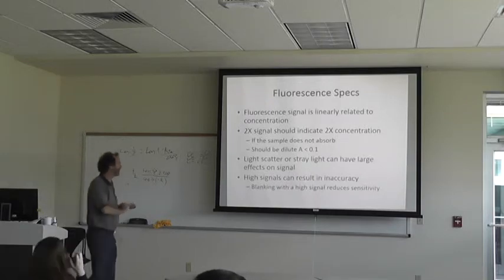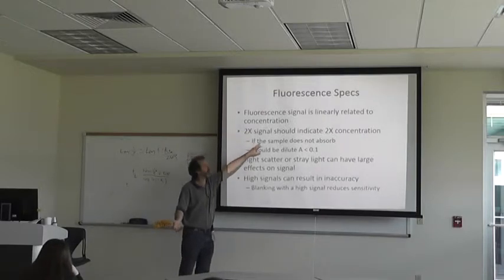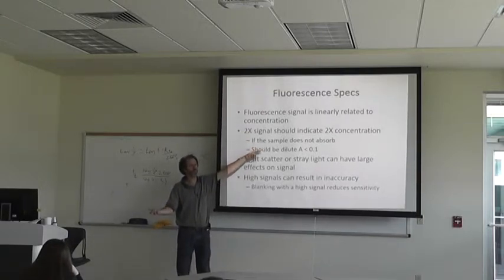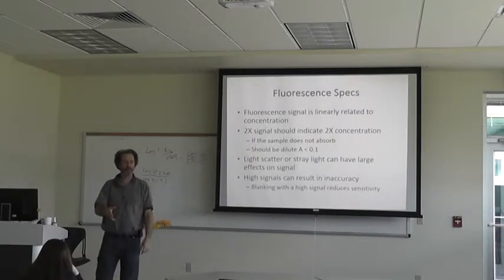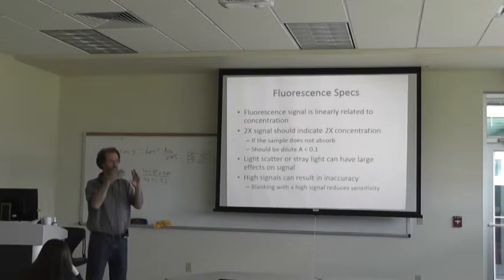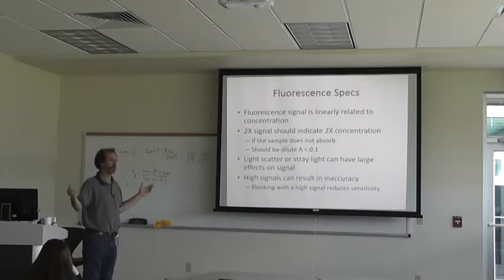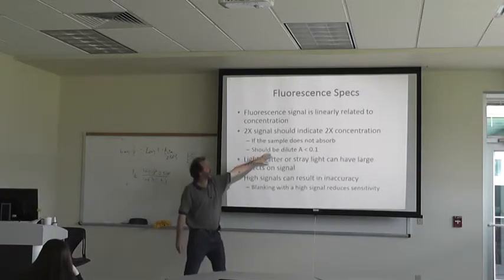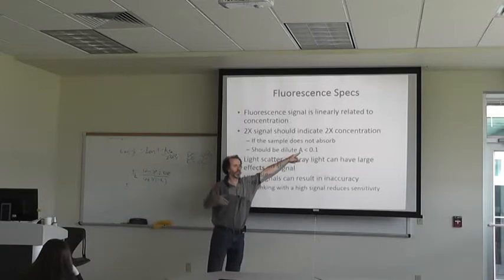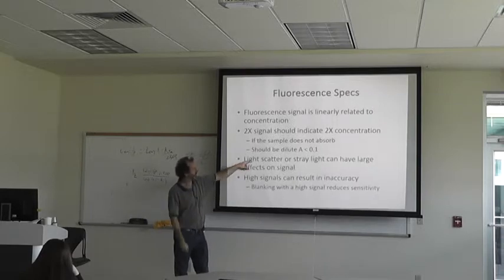Fluorescence signals are linearly related to concentration. Two times the signal should indicate two times the concentration — that's how it's supposed to work, provided the sample doesn't absorb. Sometimes samples can absorb the same light they're emitting. If the fluorescent light generated by the sample is then absorbed by the sample, that's going to throw off your signal. So the sample should be diluted so that the absorbance is less than 0.1, because you want to get all the light through and read all the fluorescence coming off.